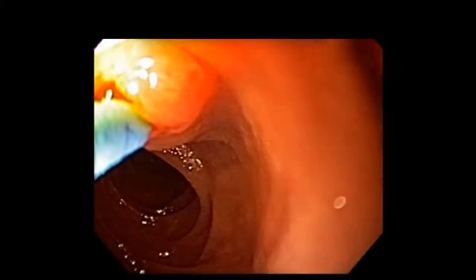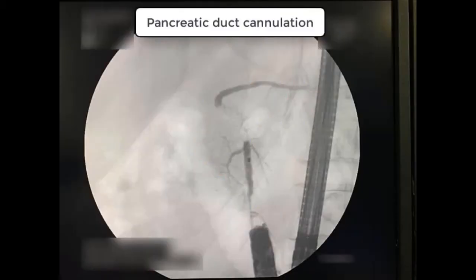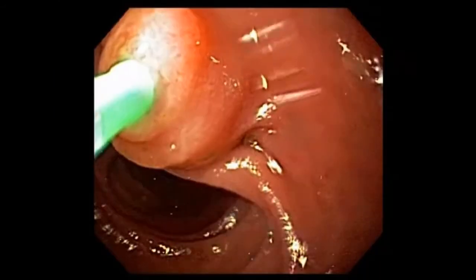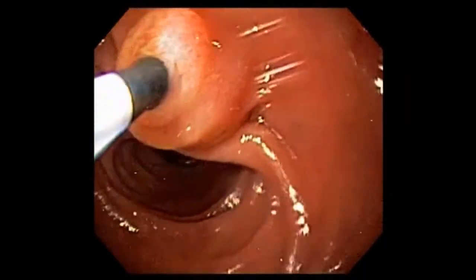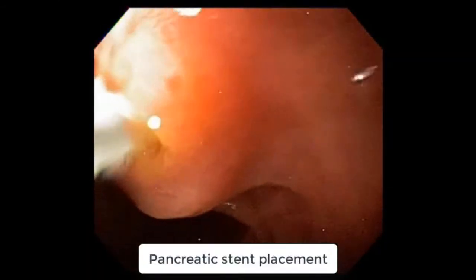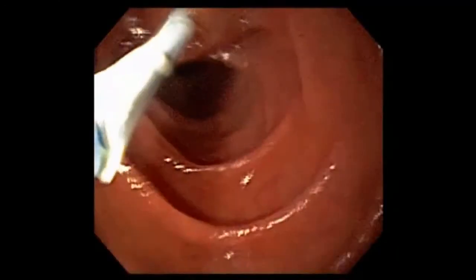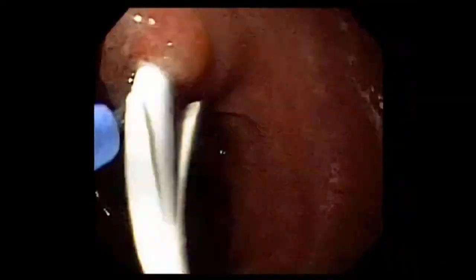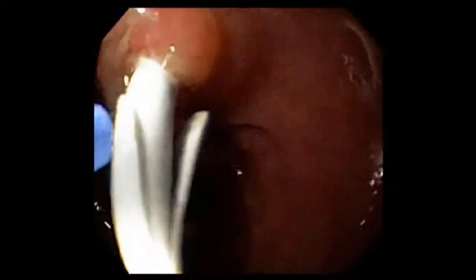During initial cannulation attempts, the pancreatic duct was cannulated. To prevent post-ERCP pancreatitis and to facilitate access into the CBD, a pancreatic stent was placed. After successful pancreatic stent placement, the CBD was easily cannulated.